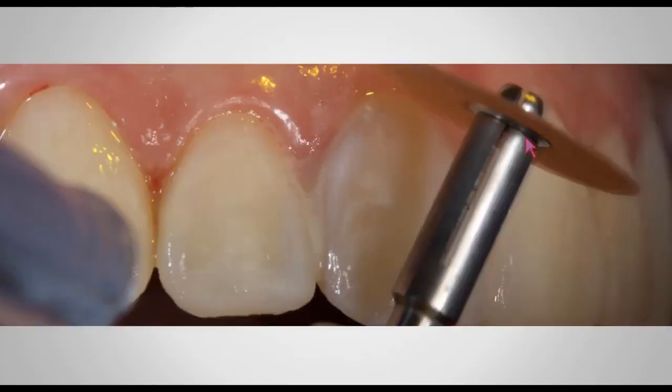Once you do that, you can grab any polishing system that you like. Right here I'm using Softflex from 3M, and you can go in and just go right around the margins. Again, the patient is not numb. All this is done without any anesthetic being infiltrated on this patient.